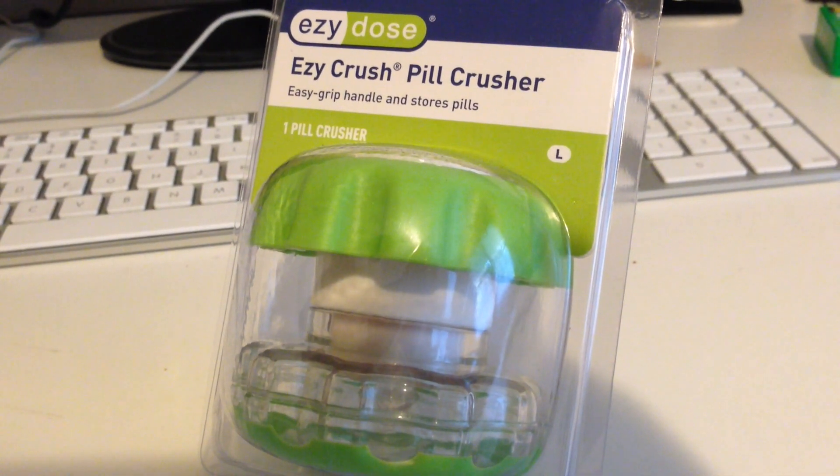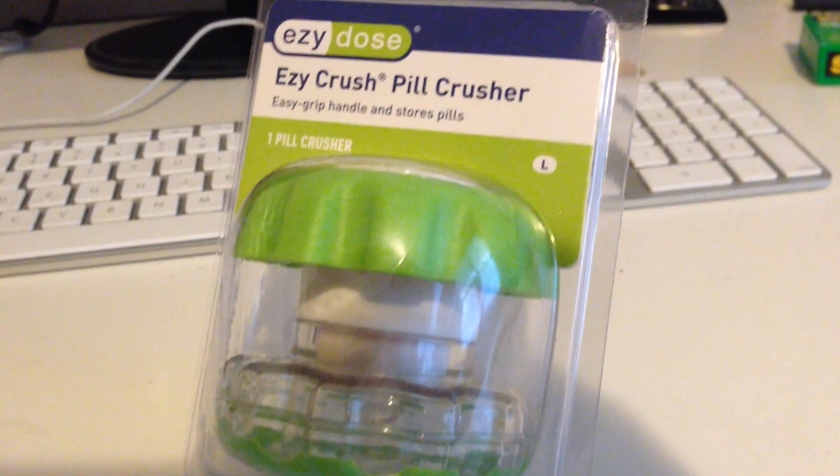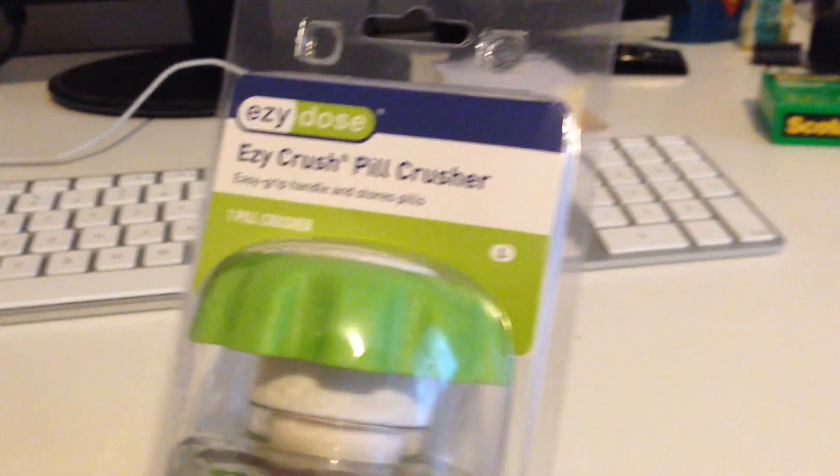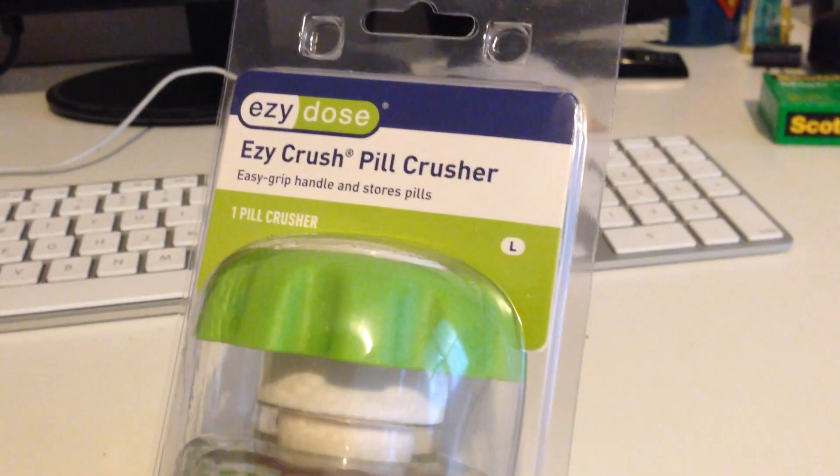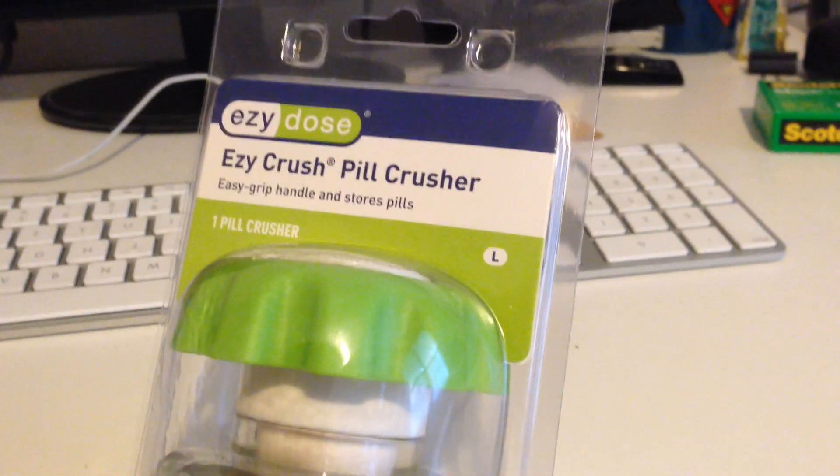Hey, what's going on everybody? This is Chris from Unbox Addiction. Here's an unboxing and opinion of the EZ Crush Pill Crusher.